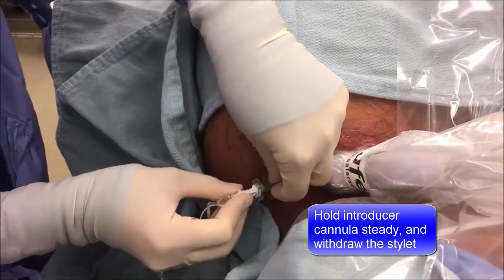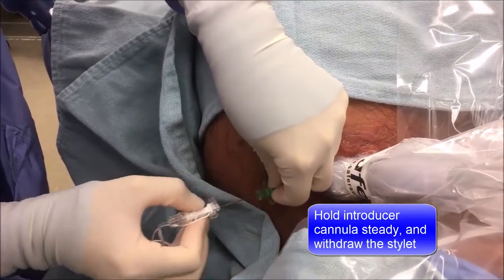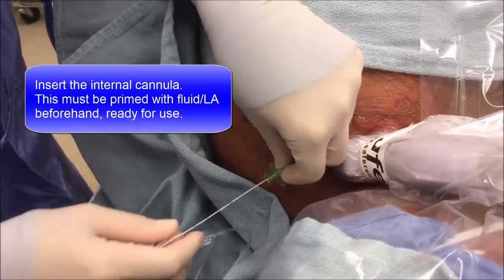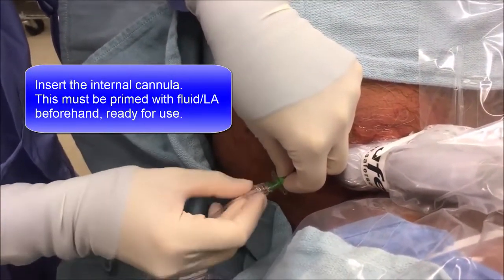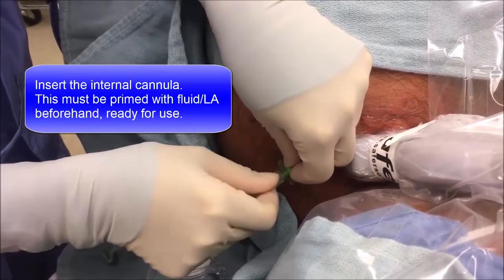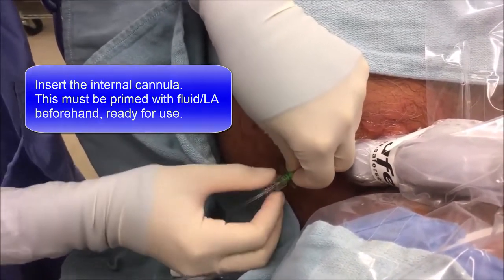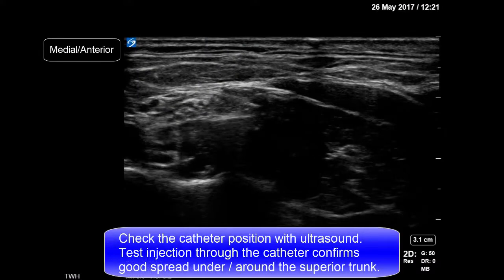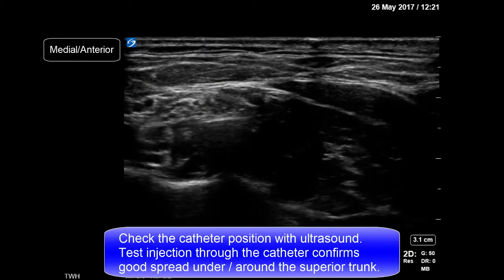Once that has been reached, hold the introducer cannula steady and withdraw the internal stylet. Substitute it for the internal cannula, which will already have been primed with local anesthetic and fluid ready for use. Use the ultrasound to verify the position of the catheter.